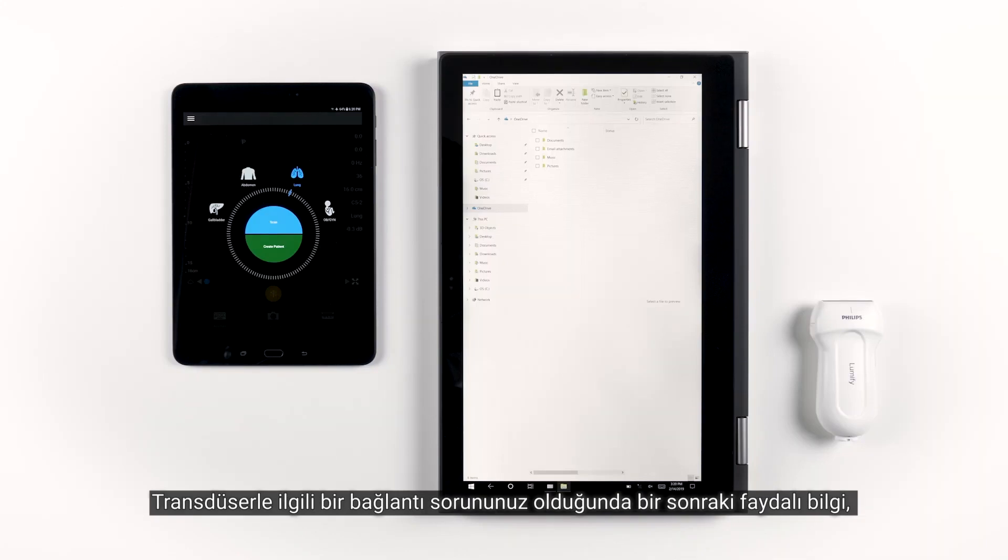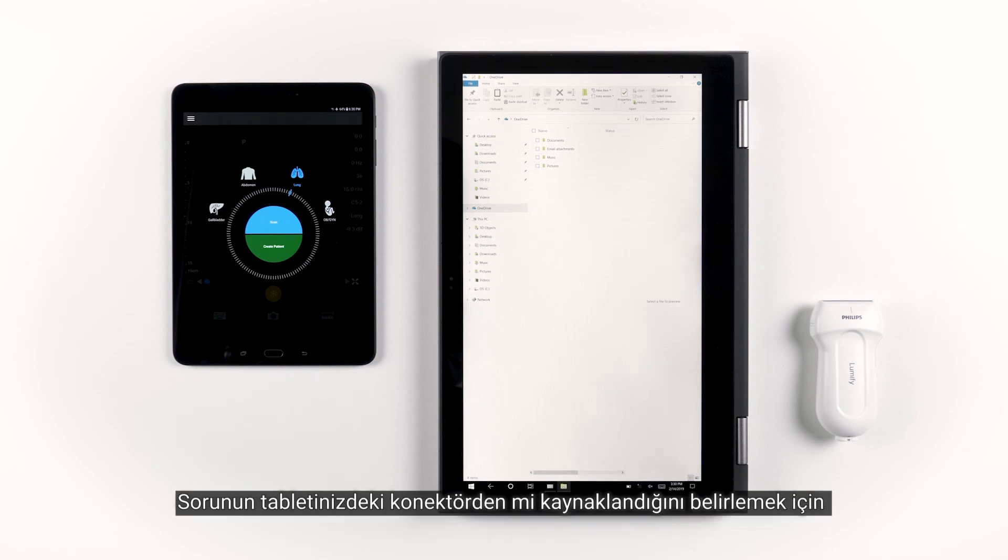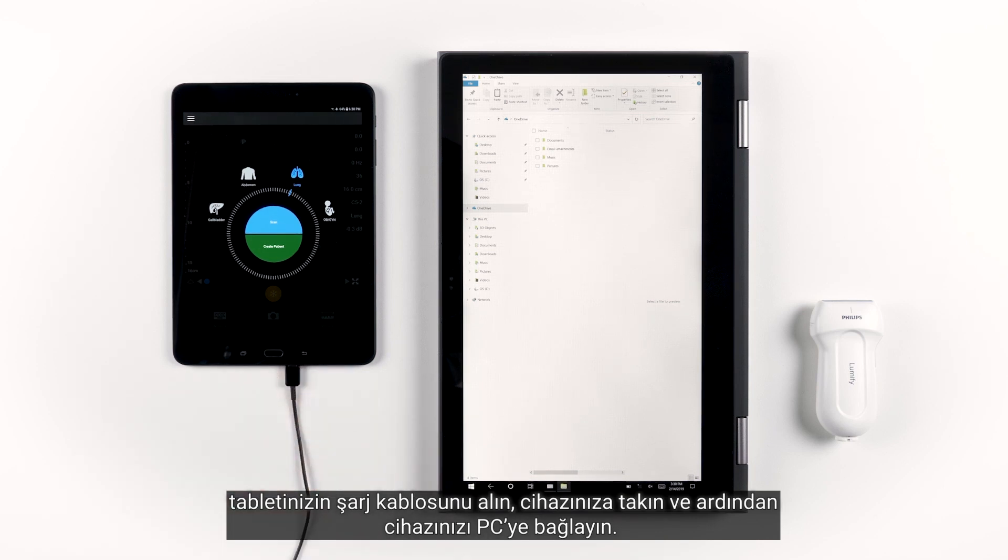In the unlikely event you experience some sort of transducer connection issue, this next tip will help you figure out if there is a problem with the cable, the tablet, or the transducer. To determine if it's the connector on your tablet, get your tablet's charging cable, plug it into your device, and then plug the device into your PC.